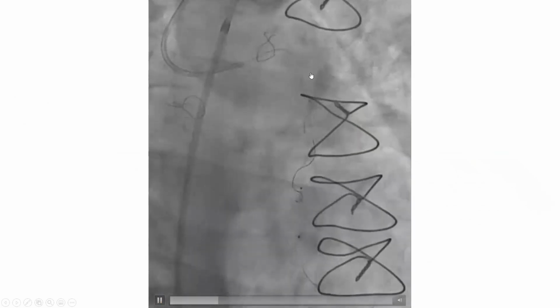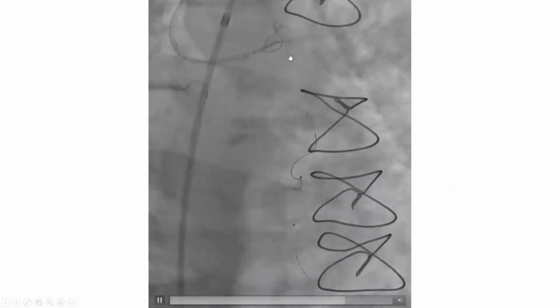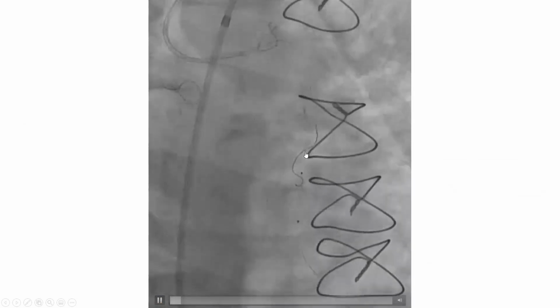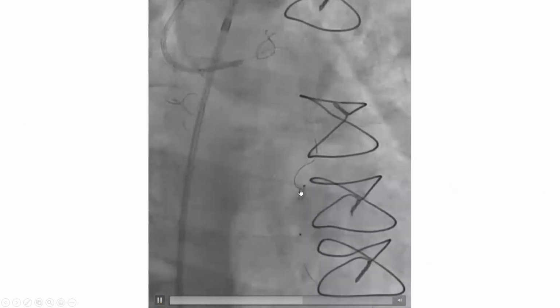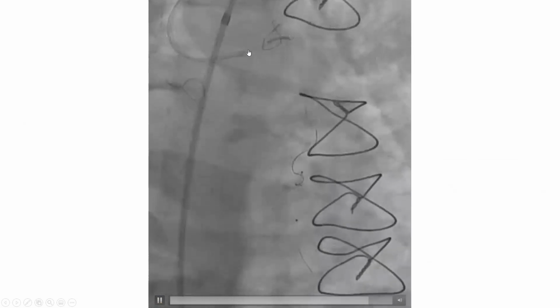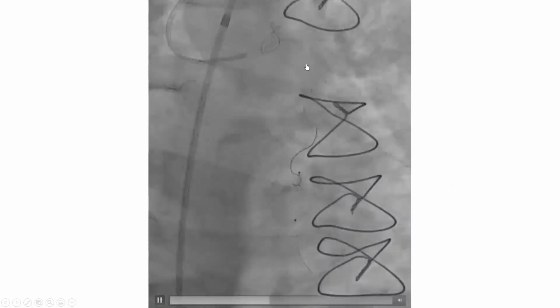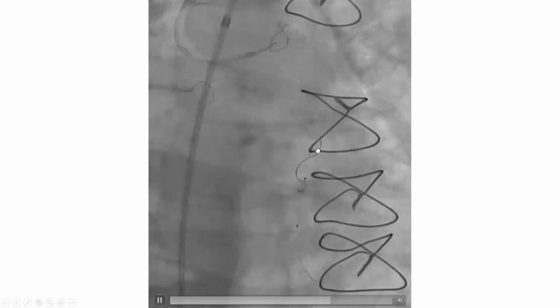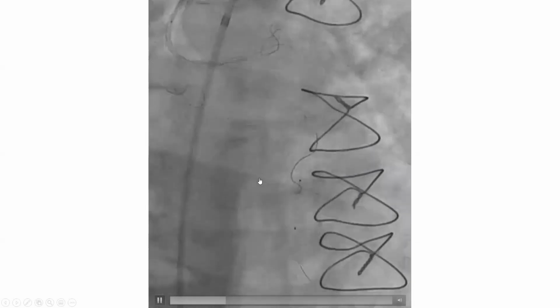This is an example where we had difficulty advancing a stent over the Spider wire. So we advanced a BMW wire all the way to this area. You cannot advance it beyond the basket. We advance it there, then we were able to advance our stent over the Spider wire. And then, of course, don't forget to remove that BMW wire once you position the stent properly and you're ready to deploy it.